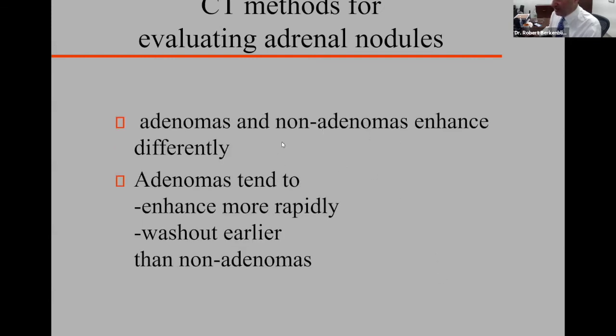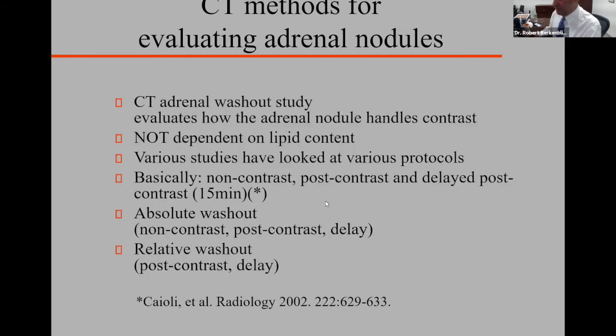Adenomas and non-adenomas enhance differently. Adenomas tend to enhance more rapidly and wash out earlier than non-adenomas. CT washout study evaluates how the adrenal nodule handles contrast, and the good news there is that it's not dependent on lipid content. Various studies have looked at various protocols, and what's generally accepted is a non-contrast, post-contrast, and a 15-minute delay to evaluate the adrenals on a washout study.